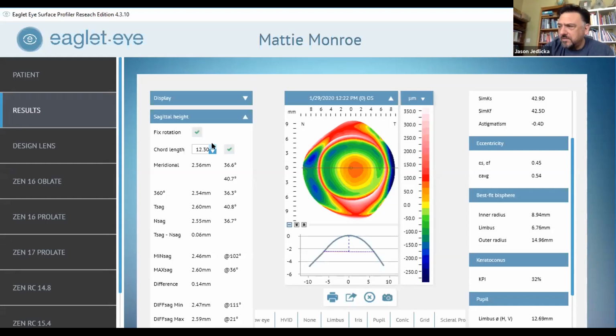Hopefully it's a very conceptual talk, but Jason, I have a quick question. Yep. Do you have a specific number in mind where you look to do that? I don't have a specific number. Historically, I'd say 100, because when you order a lens like that, they're typically going to build the sag difference in 50 micron steps. Well, 50 isn't really that helpful. I think about 100. When I see 100 microns of difference at about a 12.5mm chord, I'm going to look to go to a bi-elevational lens.